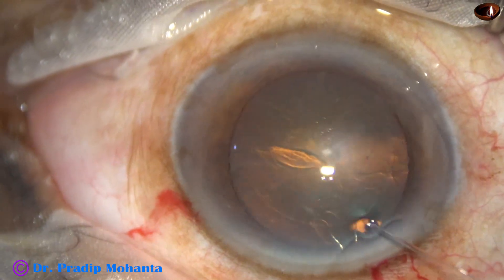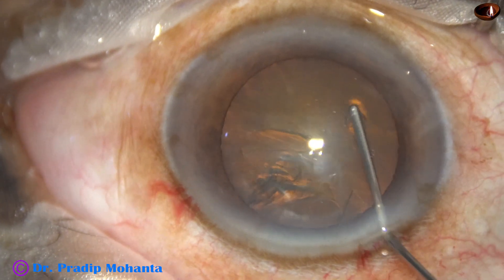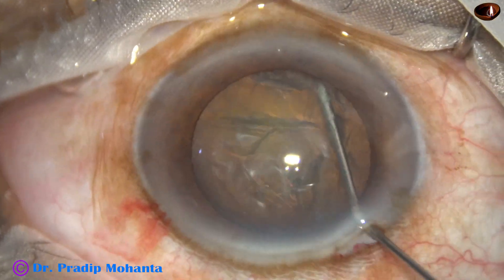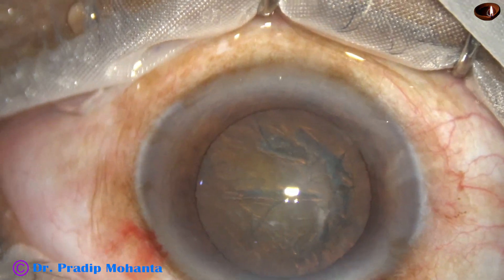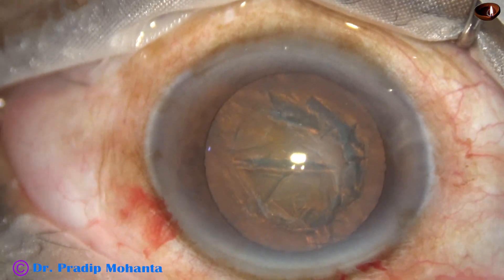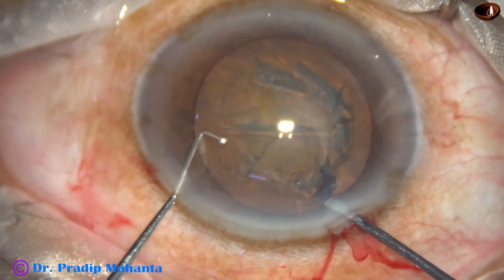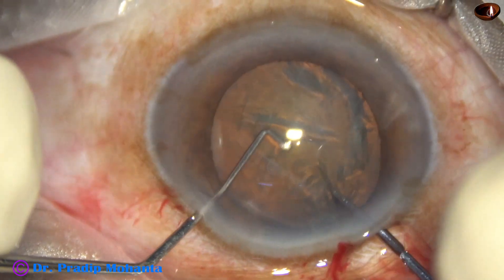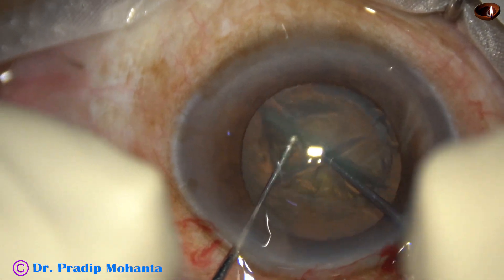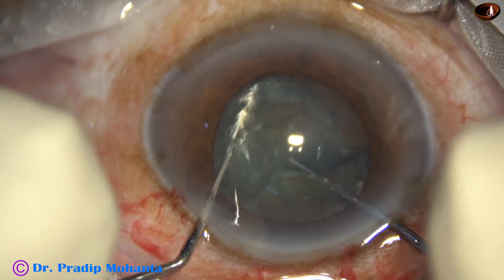Diabetic cataracts may be soft, but they do not want to be separated by stop-and-chop and divide-and-conquer technique. In direct chop also, we cannot hold the nuclear mass and it is very difficult to divide it. This instrument — a pre-chopper — works well and is being used to divide the nucleus.